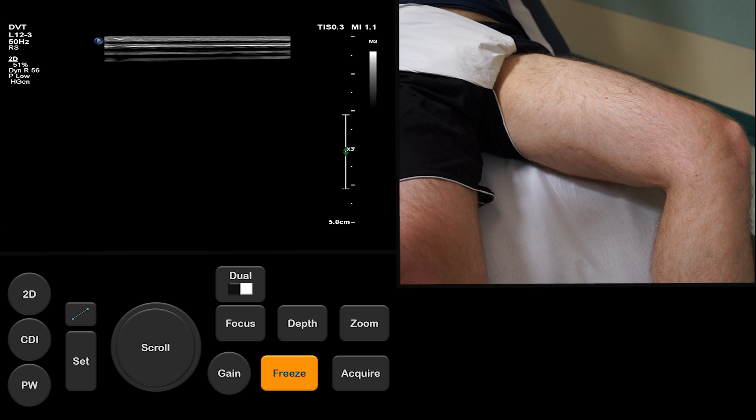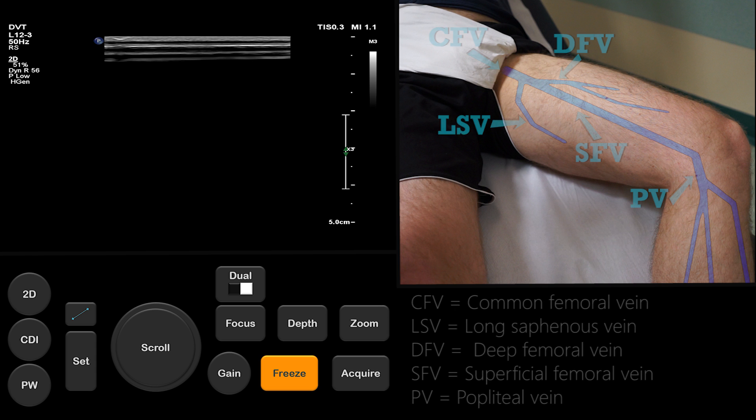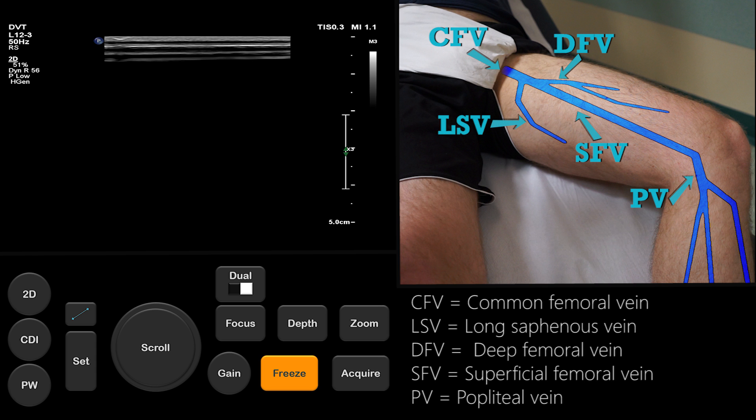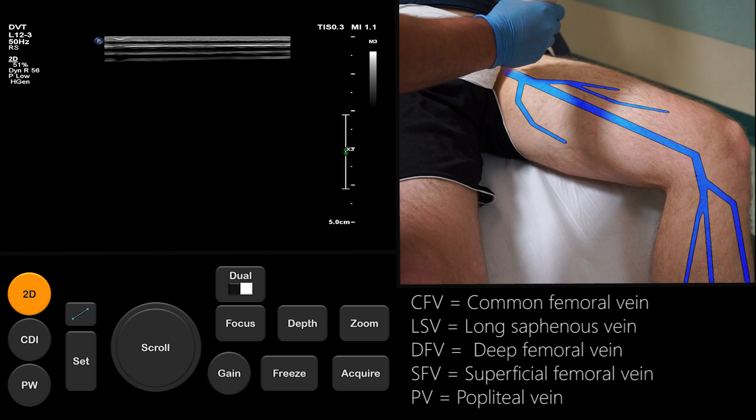The veins of interest within the thigh are the common femoral vein, superficial femoral vein, deep femoral vein and popliteal vein. We use the long saphenous vein, also known as the great saphenous vein, as a landmark for the location of the common femoral vein.